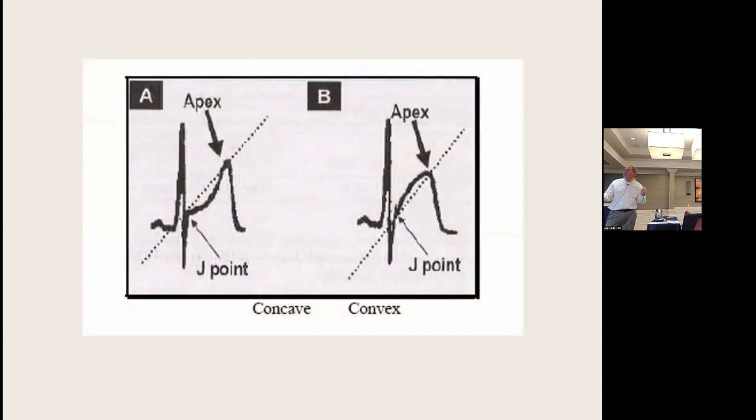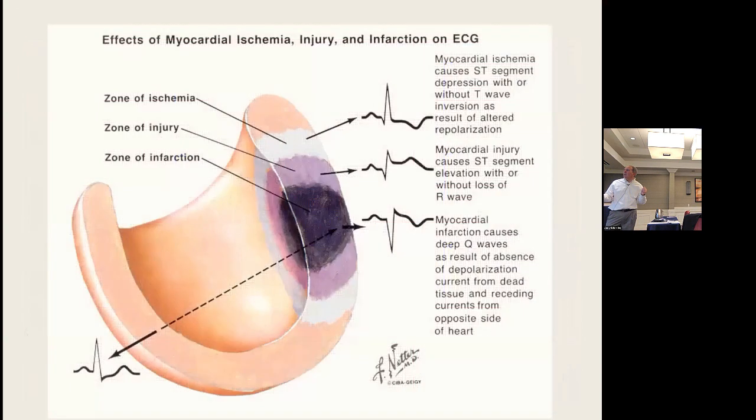So I do want to point out one thing that probably would be of value to you, and then we're going to look at the last case. And that is the formation of a Q wave. We scratch our head and we go, you just said dead tissue, no force. Why shouldn't it just be zero? No, if you kill tissue, from endocardium to epicardium, it's like if I was a mirror looking over this, it's like I'm looking through glass. I see no force because the dead tissue generates no force.